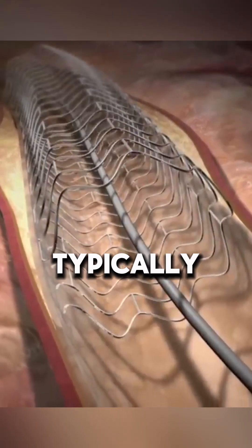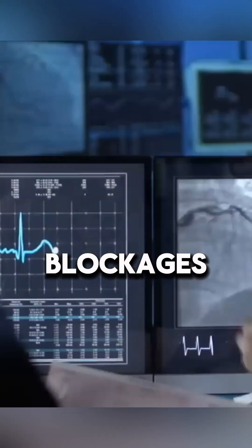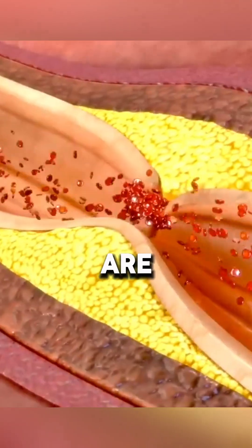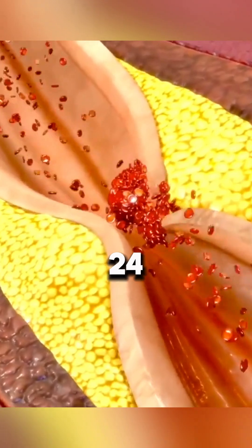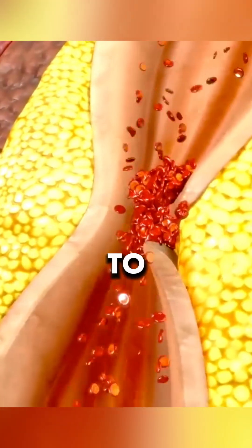The procedure typically lasts between 30 minutes and 2 hours, depending on the number of blockages. Most patients are discharged within 12 to 24 hours after the catheter is removed and can return to work within a week.